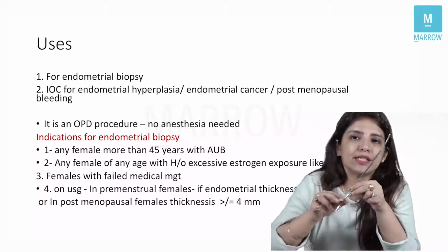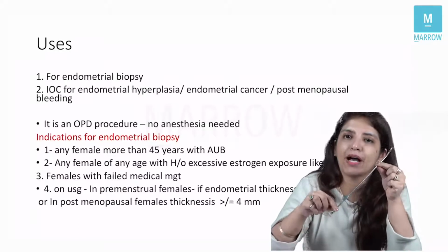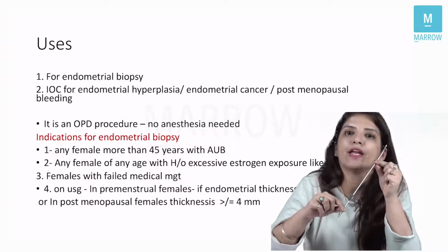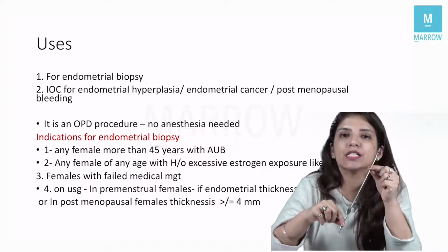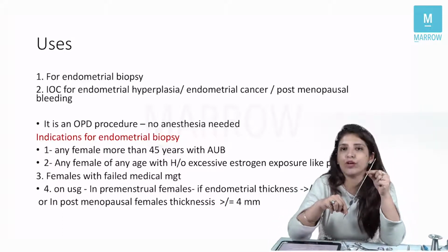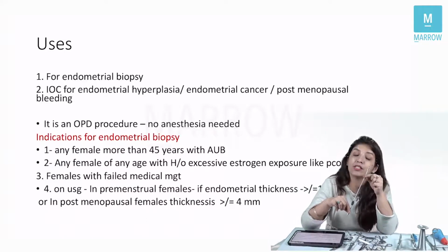So this is Novak's endometrial biopsy curette. Now, endometrial biopsy is the investigation of choice in case of endometrial hyperplasia, endometrial cancer, and postmenopausal bleeding.